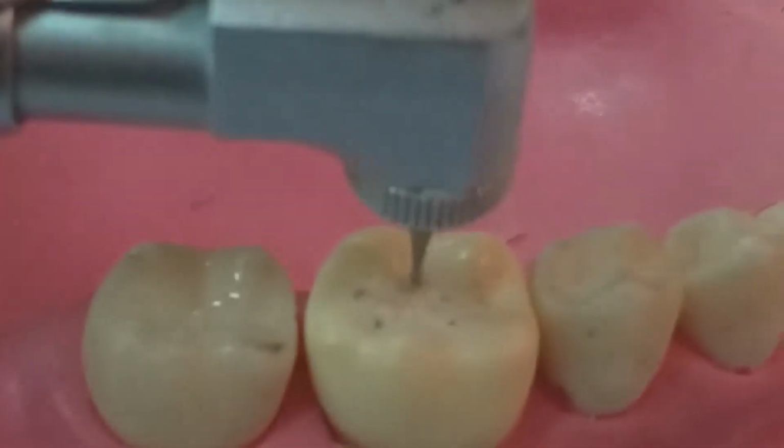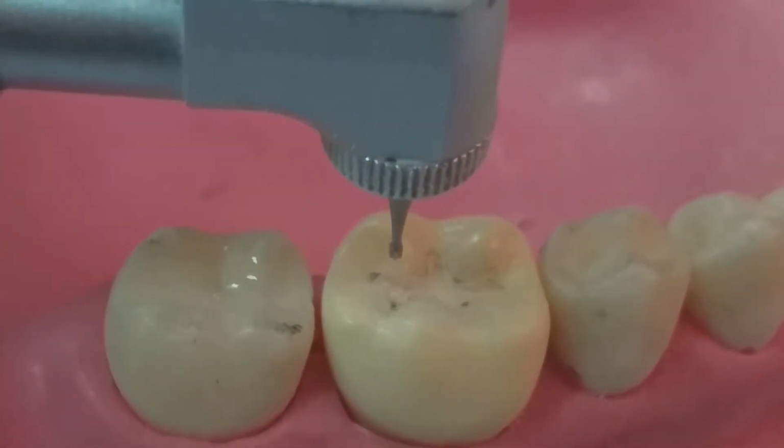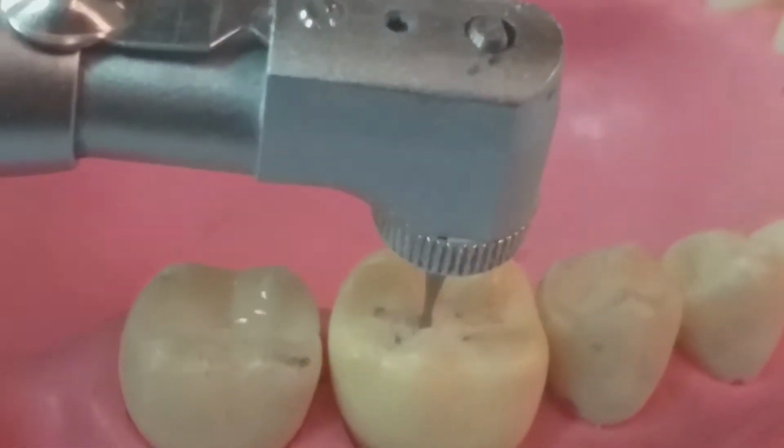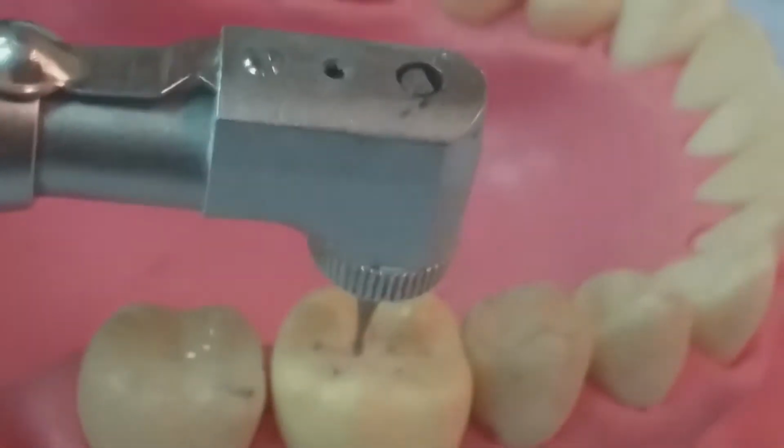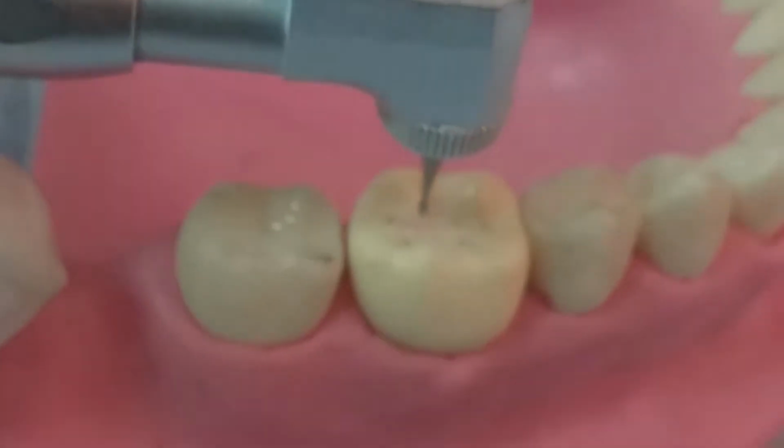Continuing our preparation to remove all parts that we didn't remove in the first. Like this.